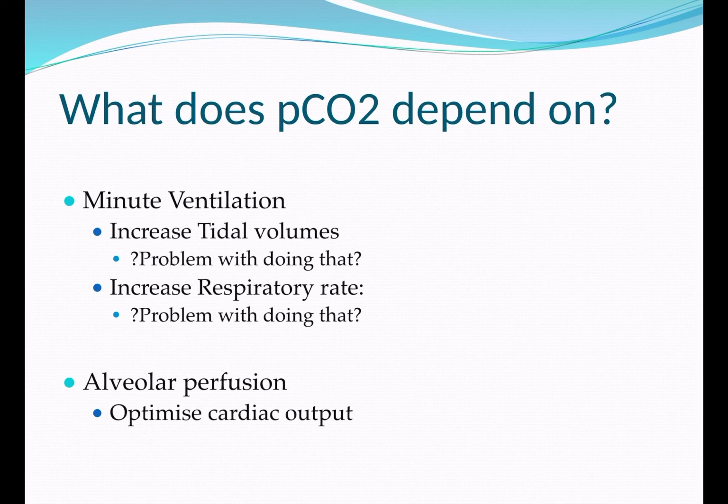So we tend not to go with a peak pressure above 30. And that's a peak in pressure mode of ventilation, or a plateau pressure is what we think about when we're talking about volume modes of ventilation.